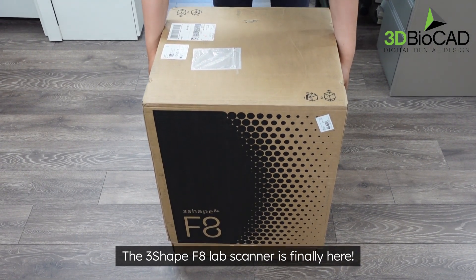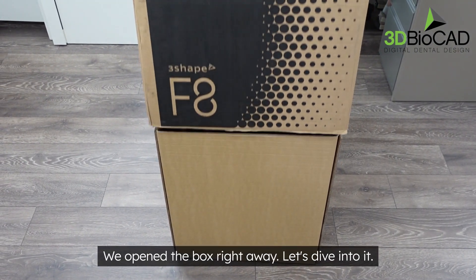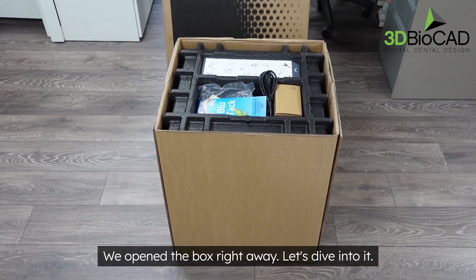The 3Shape F8 lab scanner is finally here. We opened the box right away — let's dive into it.